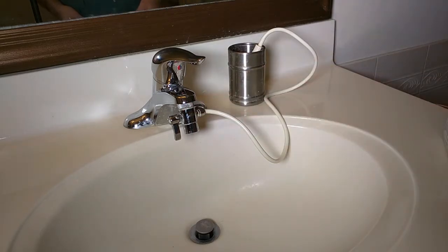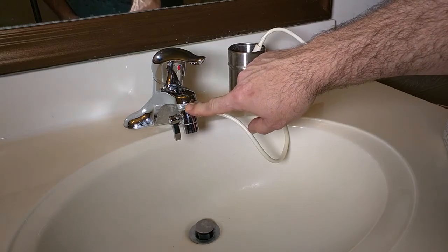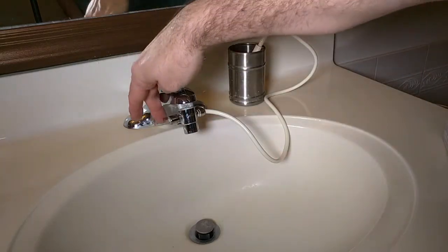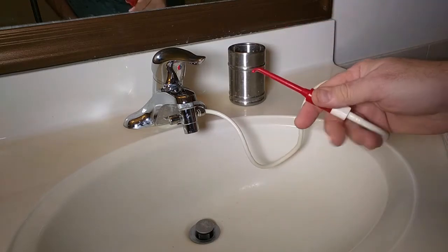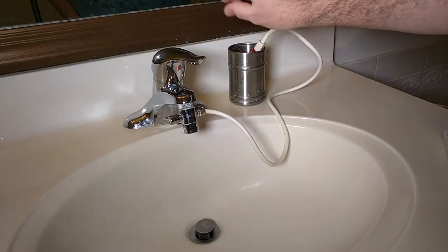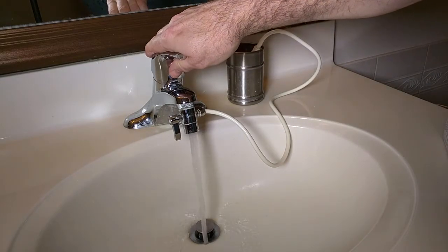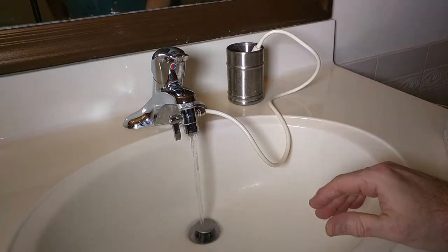It has a universal diverter valve adapter, and this right here is the diverter valve. What it does is allows you to turn it one way to allow the water to go into the nozzle for cleaning your gums and teeth, or turn the water off. So the way this works — you turn the water on and you want to have the water warm up typically before you use it.